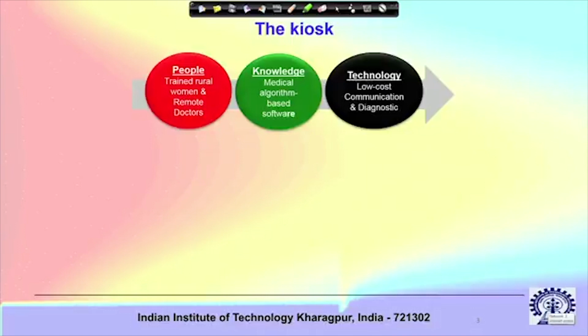So, when we talk about point of care diagnostics, we should have also a broad perspective. So, what is point of care diagnostics? It is essentially that instead of bringing the patient to a diagnostic center or a hospital, you make a handheld device which you bring to the patient, and wherever the patient is, maybe at the hospital bed, maybe at home or wherever, you bring that device and use that device for the diagnostic purpose. So, it may use a body fluid or it may not use a body fluid, it may use some other body signals maybe. But it should be at the site of the patient instead of being located at a fixed site.